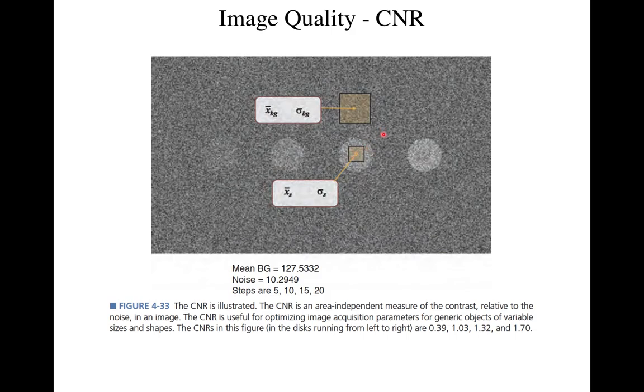If these two things are pretty close, these two sigmas get pretty close, right? In CT, if this thing gets really big, obviously, then this too is going to start getting bigger. And what that means is if I have an object that absorbs a lot of x-rays, right, basically the noise on estimating how many I got there goes up.